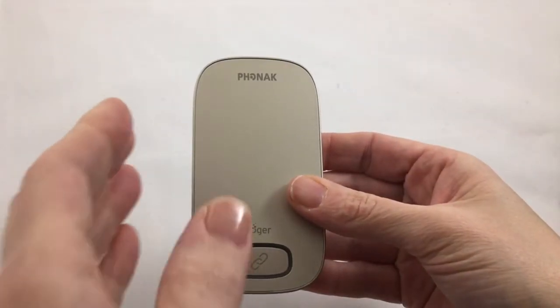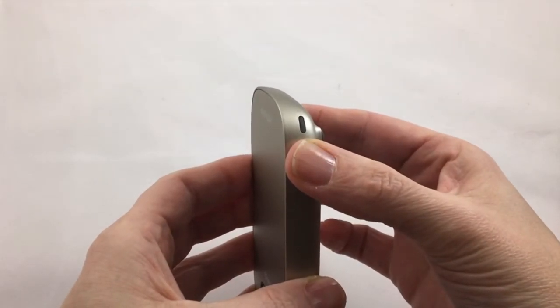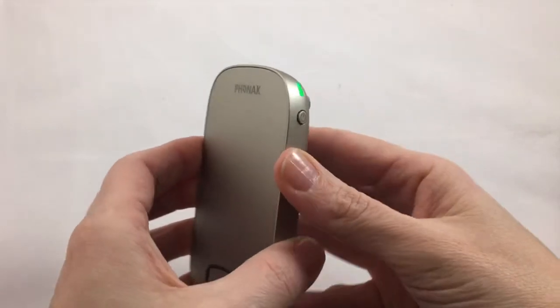To switch on, press the on-off button on the side of the Roger Multimedia Hub for 3 seconds. The green indicator lights will flash until fully booted.